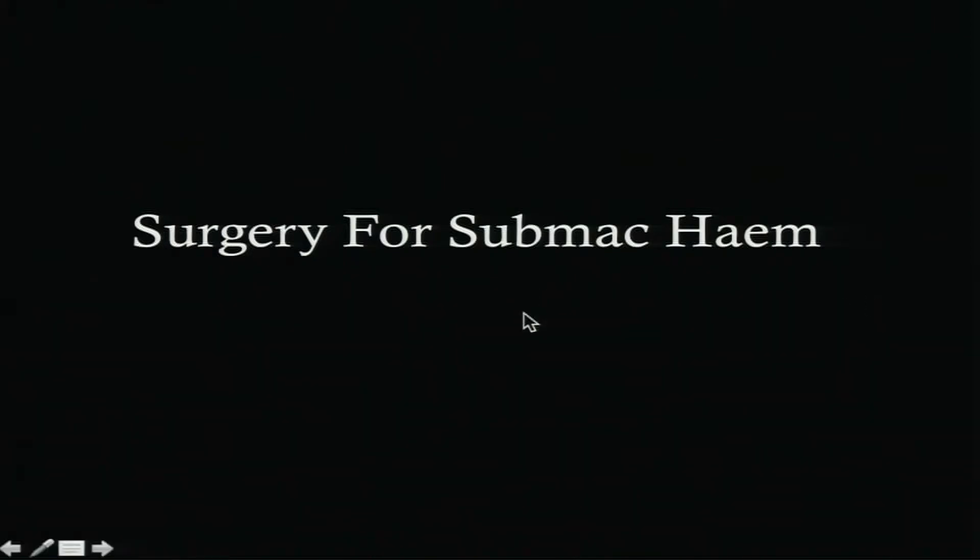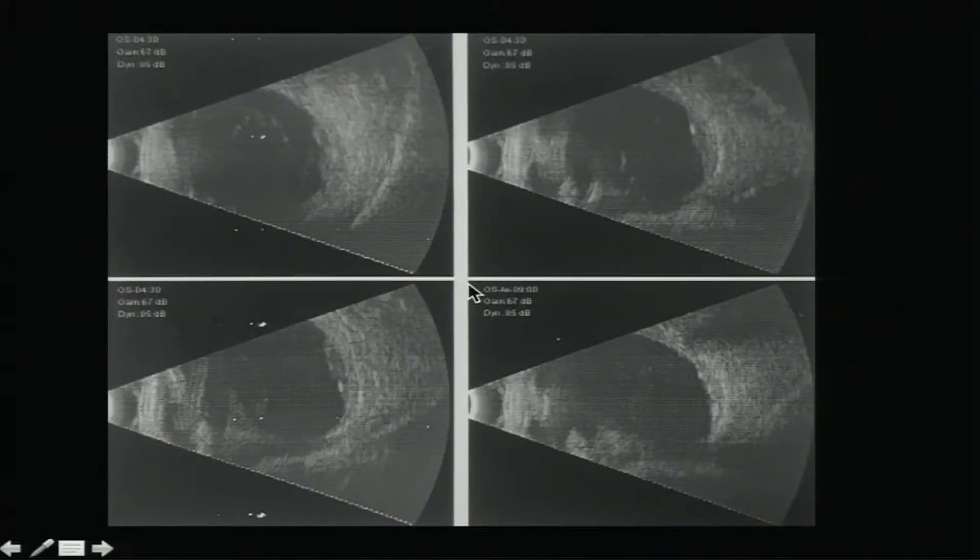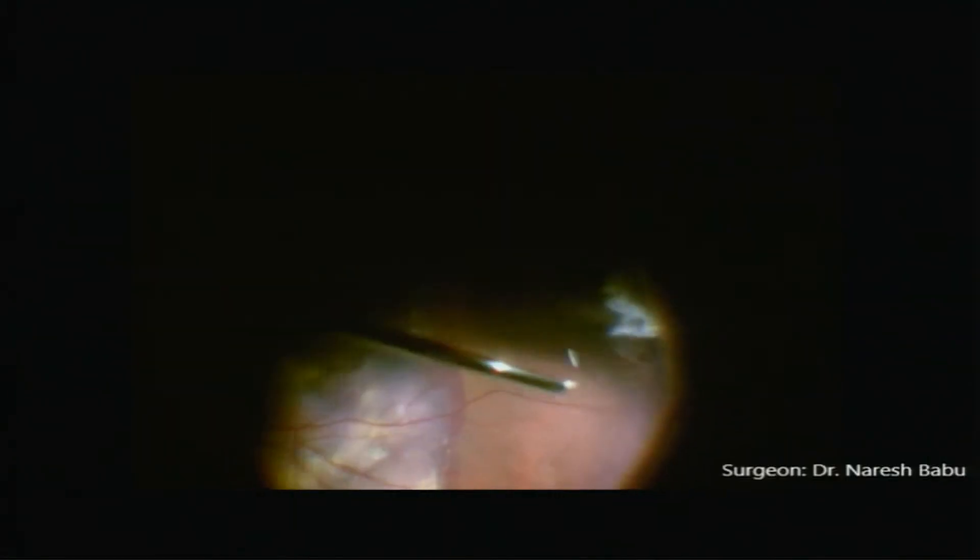This case involves vitreous hemorrhage with subretinal blood. After clearing the vitreous hemorrhage we essentially create an artificial giant retinal tear. I usually go for 180 degrees of cauterization in the periphery because when removing blood and membrane it gives a peaceful working space. Then we induce a retinal detachment.